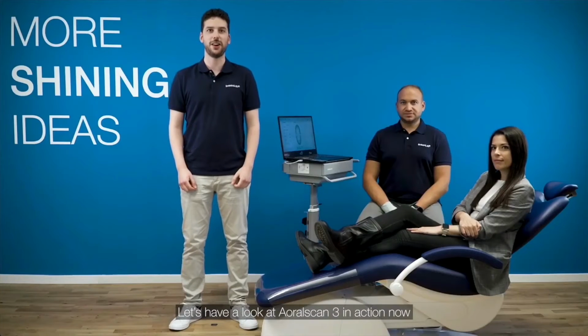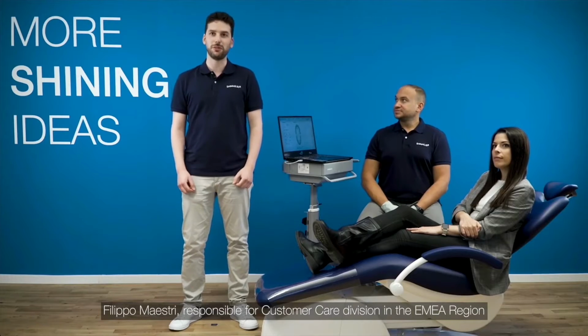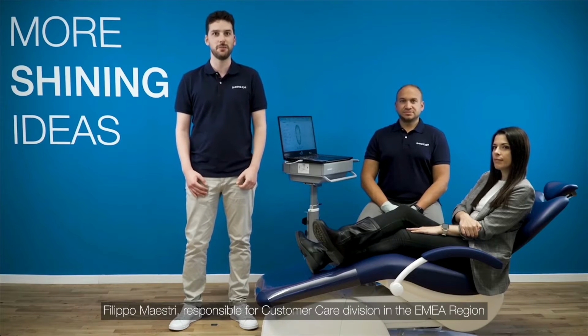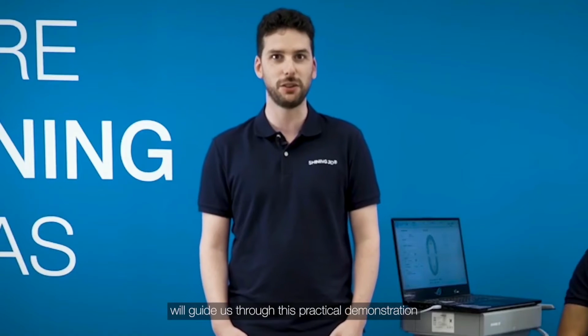Let's have a look at AORALSCAN 3 in action now. Filippo Maestri, responsible for Customer Care Division in the EMEA region, and Rita D'Amico from Sales Department will guide us through this practical demonstration. Thank you, Riccardo.